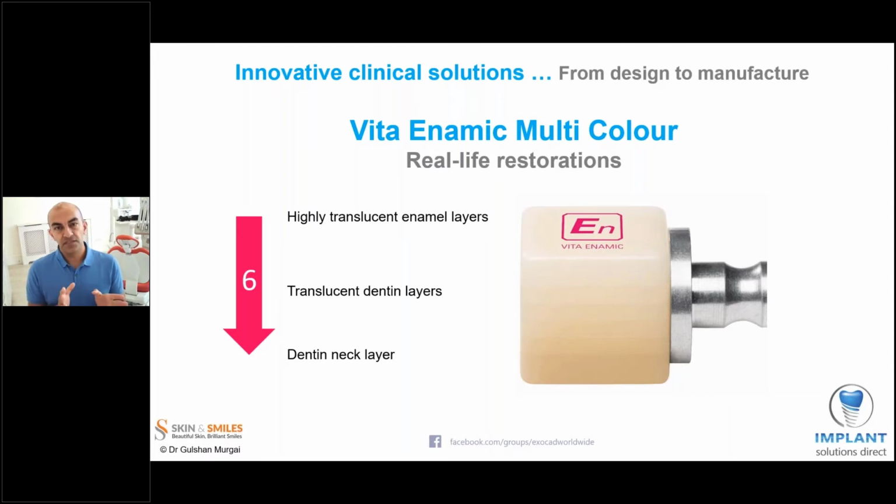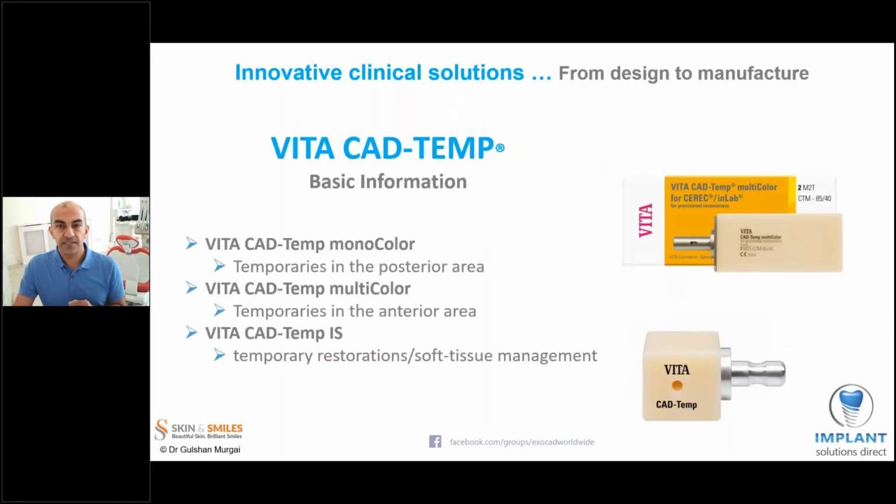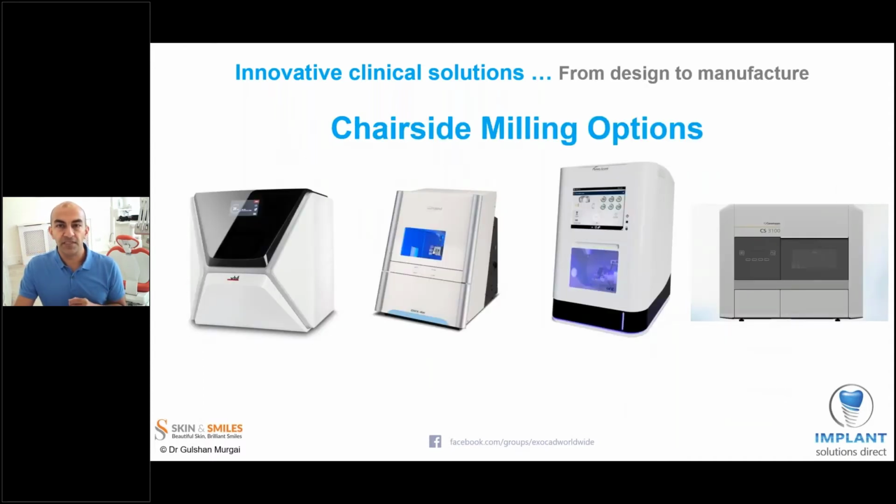So I certainly do appreciate the talent of laboratory technicians, and certainly there's a massive place in my daily work for labs and laboratory technicians. But what I'm trying to say here is that with the invention of multiple polychromatic materials, you can do anterior restoration successfully. VitaCAD Temp, I already touched on. That's a reinforced PMMA. Again, that's available in monochrome and multicolor.